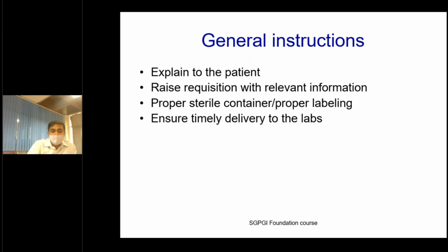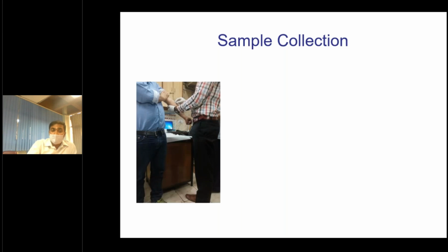We are very fortunate to be in this institute. The samples are being transported using a pneumatic system, so one thing is automatically taken care of. The things that you have to watch are, either you are taking the sample or you are witnessing the sample being collected by the sisters at the bedside. So if you look at this picture, obviously sampling is being done. He's wearing all the precautions and he's taking the sample.